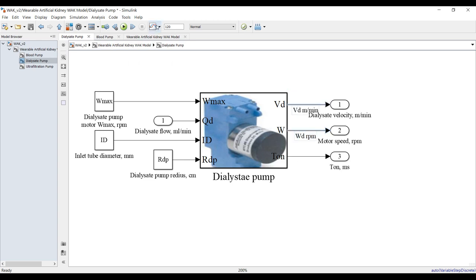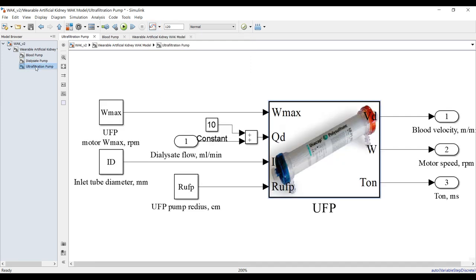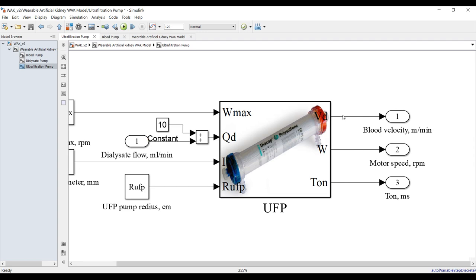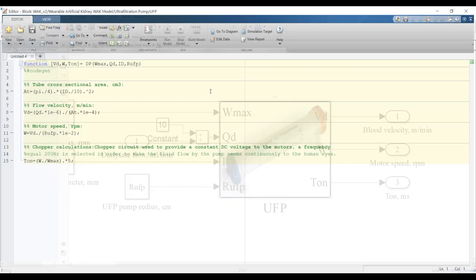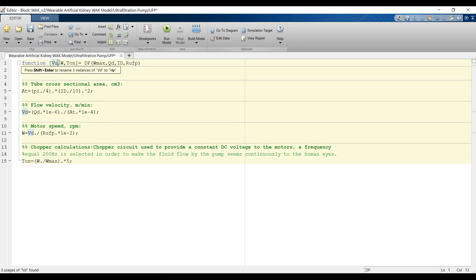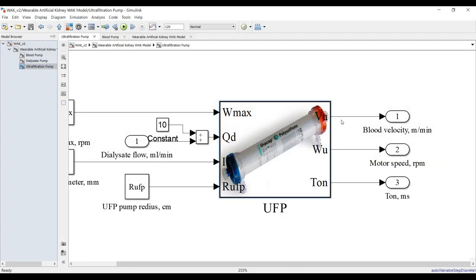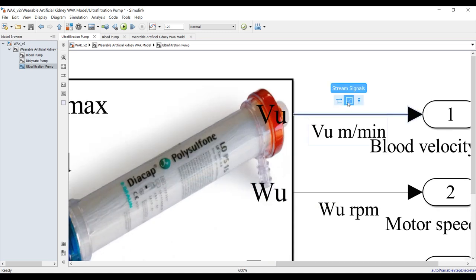I need to select this output and send it to the Data Inspector. The same for the dialysis pump: VD in meters per minute and WD in RPM, to compare. For the ultrafiltration pump: VU in meters per minute and WU in RPM. To send to the Data Inspector, click here — you can do it from here or from here.